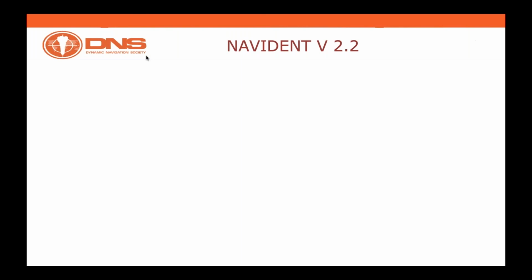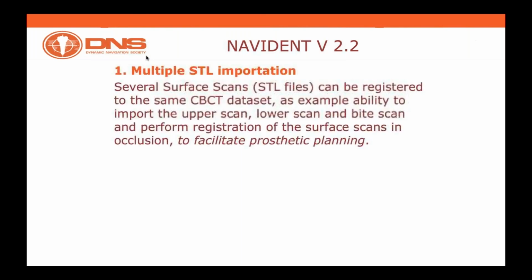So we thought to split this presentation in two. One will, of course, take place today, and the second one will take place in the near future. And the reason why we thought to split it is easily given by the sheer amount of features that we are currently presenting.